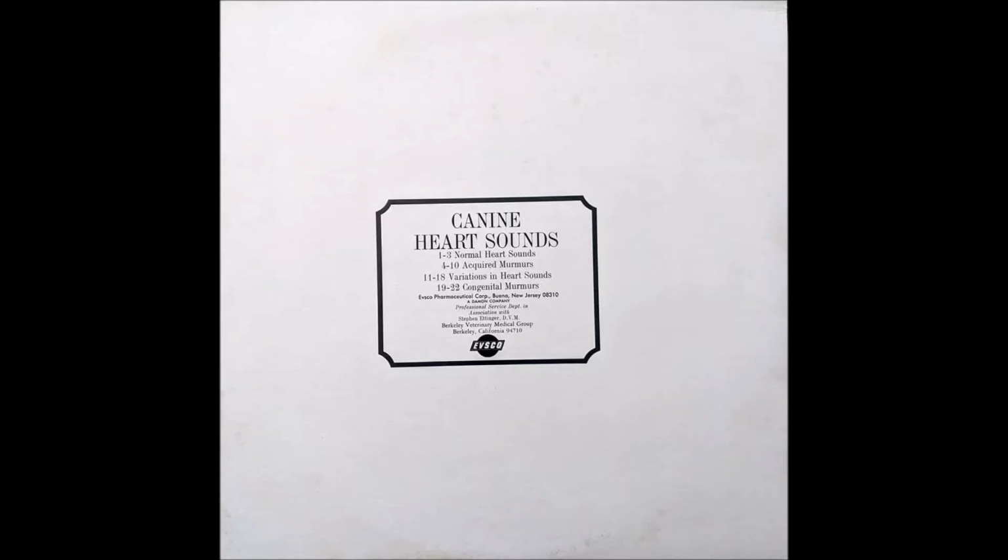The pulmonic valve region is located by moving the stethoscope cranially along the left sternal border to the 3rd to 4th intercostal space. The aortic valve is just dorsal to and slightly caudal to the pulmonic valve at the middle third of the thorax. The tricuspid valve sound is best heard at the junction of the middle and lower thirds of the right thorax near the 4th intercostal space.